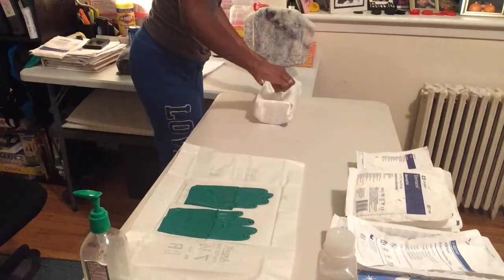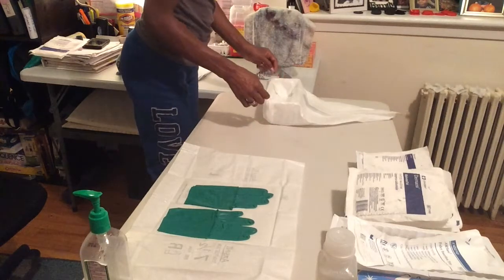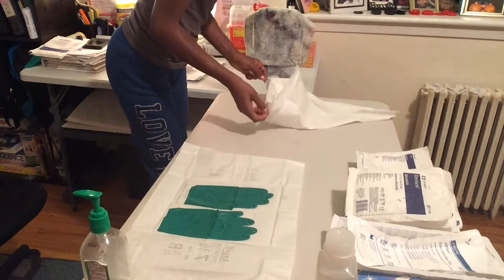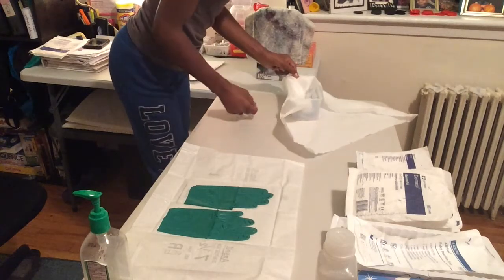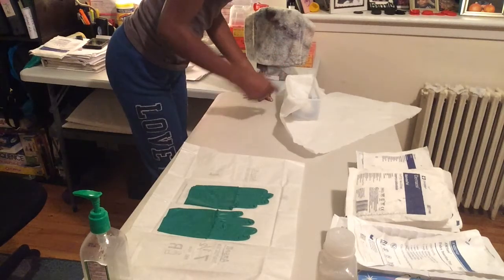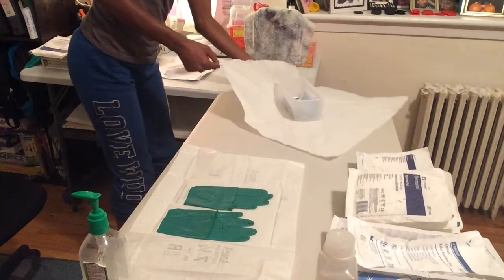Now I'm going to go ahead and open up this cath kit, starting with the flap farthest away from me, then the sides — starting with my right side, then the left side — and then I'm going to open the one closest towards me, being sure to touch only the edges.